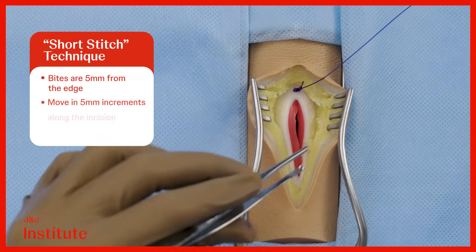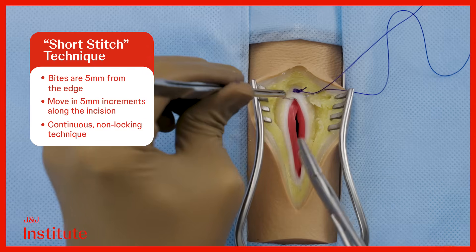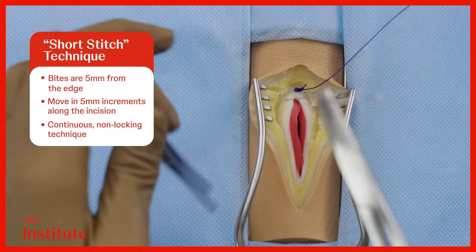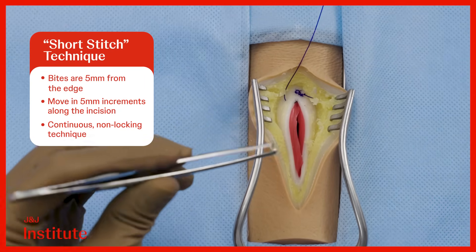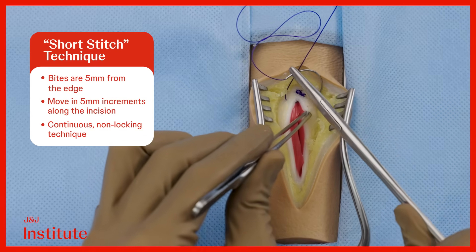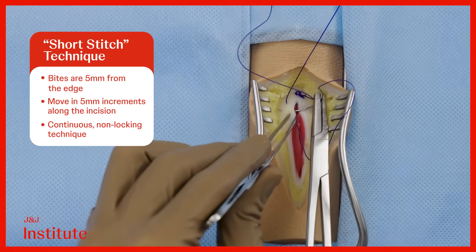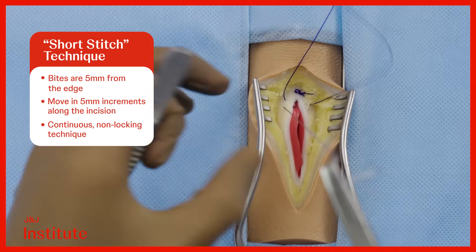Proceed with the short stitch technique, taking bites that are 5 mm away from the fascial incision on both sides, and ensure that each successive pass moves 5 mm along the incision. As per the recent recommendations, there is no requirement to close the peritoneum in a separate layer.